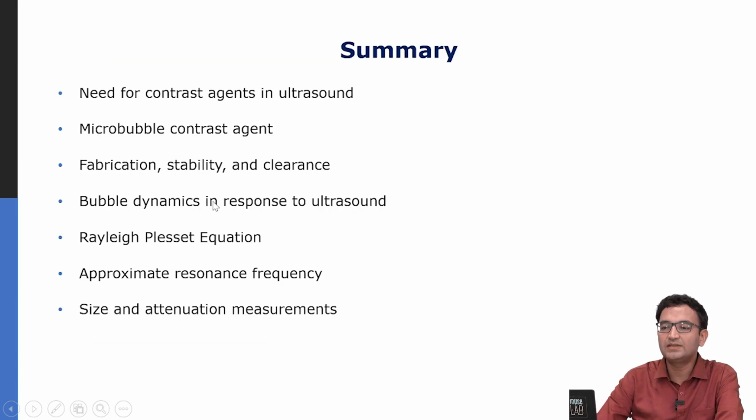So let me summarize. In this lecture, we discussed the need for contrast agents in ultrasound to visualize blood-filled organs. We discussed why microbubbles are an excellent contrast agent for applications in ultrasound. We discussed how we can fabricate these microbubbles, how they are stabilized, and how they are cleared out from the body, which is an important consideration for safety.